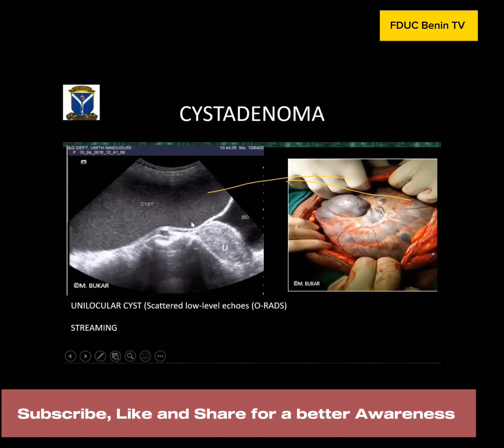Now, as I said earlier, I have not seen a case of endometrioma without associated pelvic adhesions. So at times, if you are in doubt as to whether it is a cyst adenoma or an endometrioma, you can apply pressure here. When you apply pressure and you see a movement of these particles towards the other end, that is called streaming, and that is a feature of cyst adenoma. In endometrioma, because the particles are dense, they will not stream. So this is one way you can differentiate between mucinous cyst adenoma and an endometrioma.